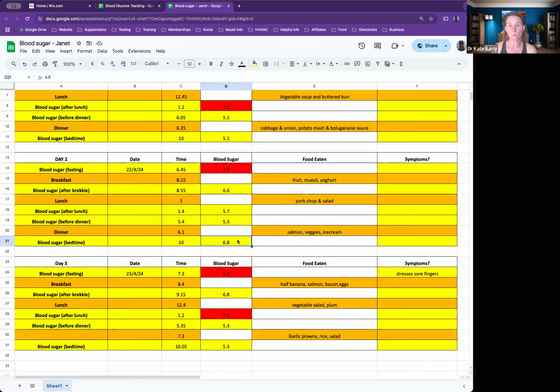she's still at 6.8. So you can imagine that if, after 4 hours, the blood glucose is still 6.8, had she done a test an hour after dinner, you can almost guarantee that that would have been much higher. This score would have been much higher when it peaked. So I would probably flag this knowing that information.